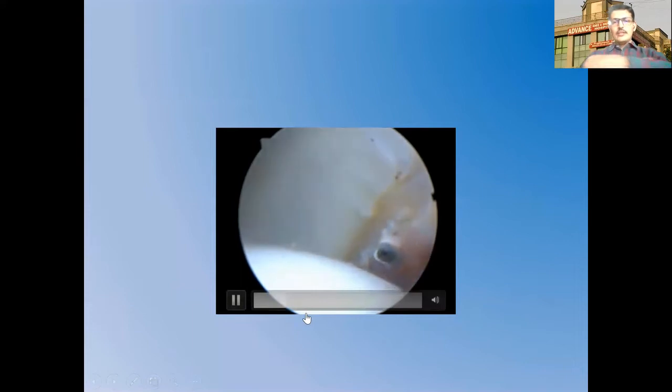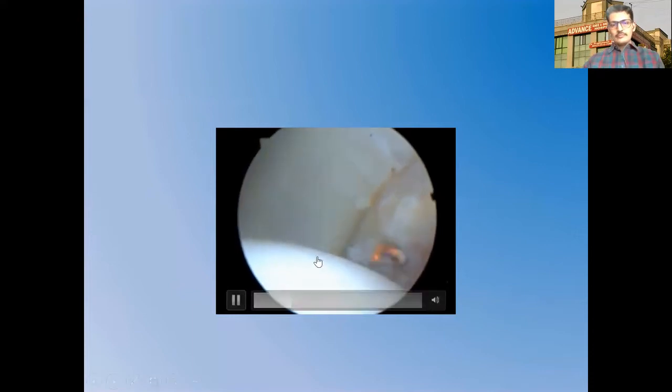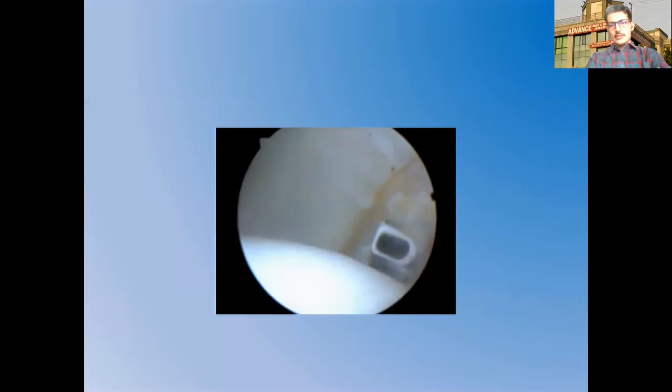A generous capsulotomy is an important feature in these cases — it significantly increases instrument maneuverability. A good and generous capsulotomy is performed here.